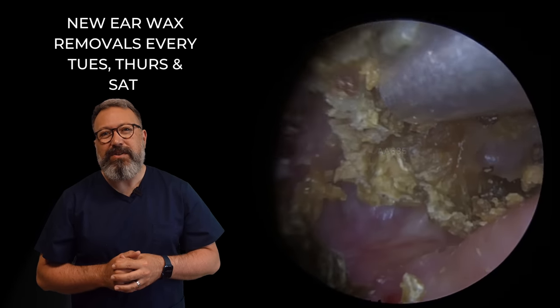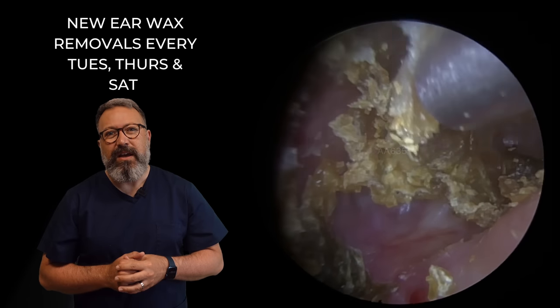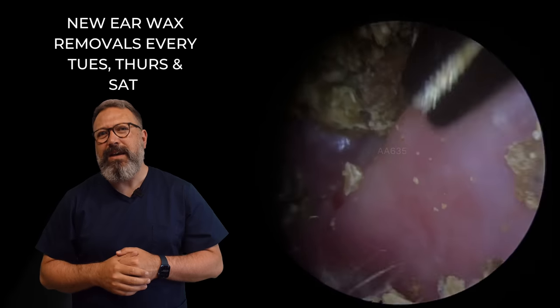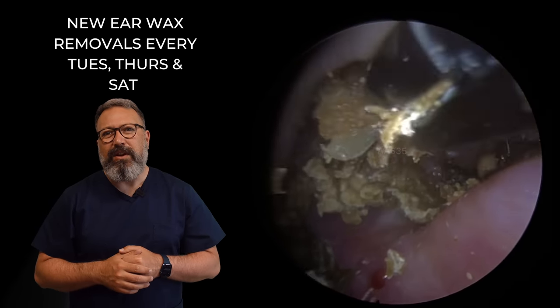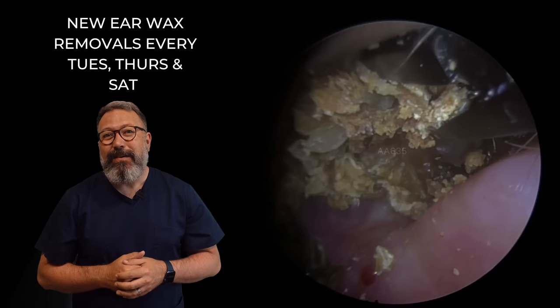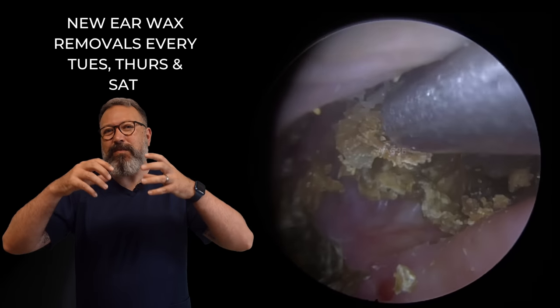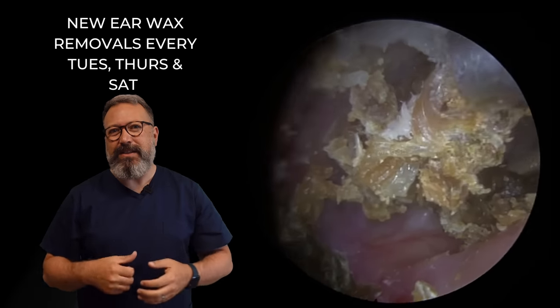I think we may have to switch. Is it loose enough for us to get a suction tube on here now? Because it was too tough to do that earlier. Starting to pull this layer of dead skin down from the top — look how this is starting to peel. Let's get the forceps on this now. Is this going to work? Look at that whole section just coming forwards there. I'm just trying to get a grip, but you can see it's just breaking away in the jaws of the forceps. Every time we try and get a grip on the next section, those little bits have all jammed up against the end of the forceps there.